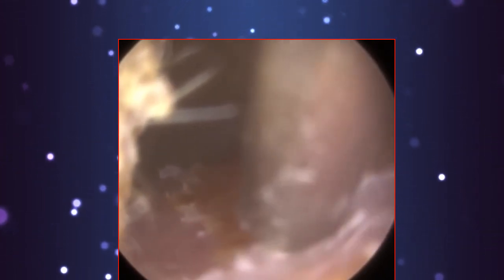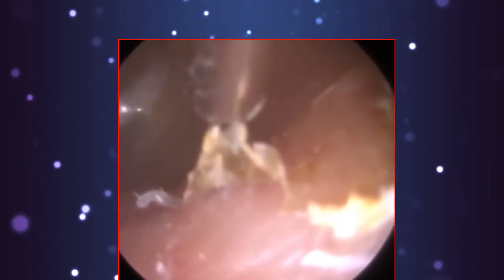So you can see you've got this bit of skin here, the base of the ear canal, just using a fine end gauge. There's been a bit of controversy, I think, with my terminology. Apologies, guys. I'm using a fine tip sucker. I'll just call it that from now on, if I can remember. So just gently lifting this off the base of the ear canal. I'm going to be really, really gentle. I don't want to touch the canal wall. That game of Operation, the patient will start buzzing and not be very happy if I do, because it will be very uncomfortable for them.